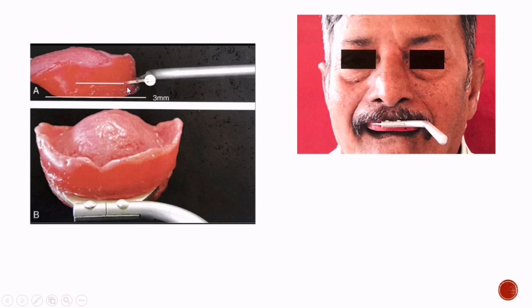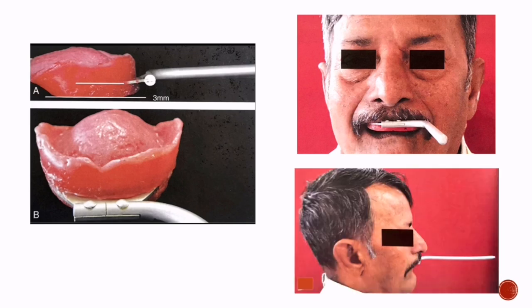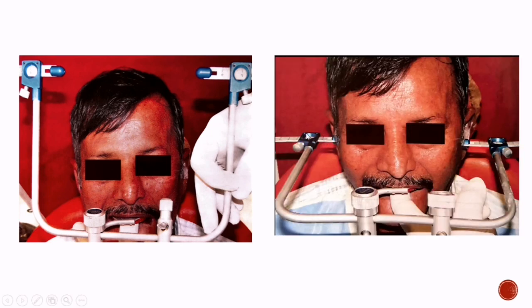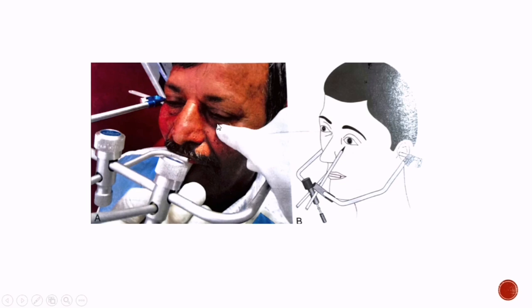The maxillary rim with the attached bite fork is inserted into the patient's mouth, and the parallelism and centering of the attached bite fork are verified. The U-shaped frame is supported by two fingers, gently rotated, and inserted into the stem of the bite fork in the patient's mouth. Then the condylar rods are unlocked and the condylar heads are placed on the patient's right and left condylar centers on the previously marked points. The infraorbital notch is then palpated and the orbital pointer is set to this third point of reference.